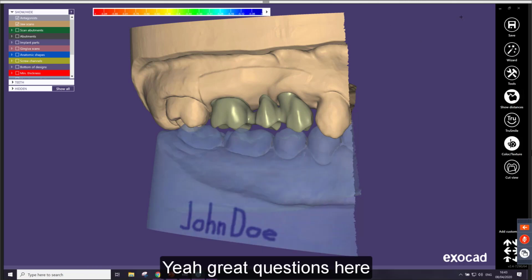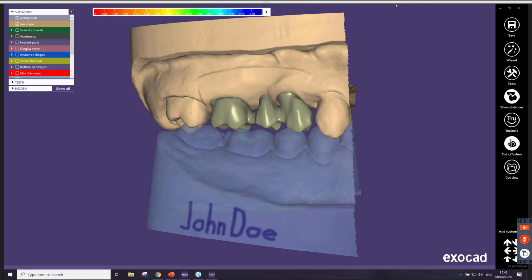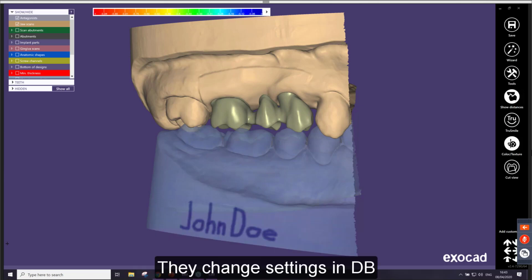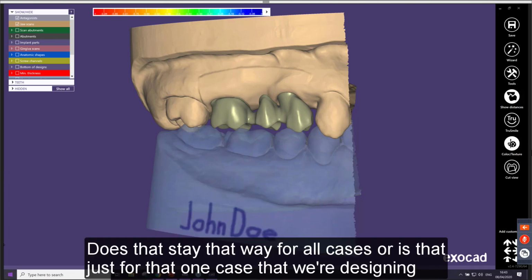Yeah, great job, Tina. Yeah, we do have a few questions here. Okay. Actually, we had a couple questions. This isn't completely pertinent to the webinar, but a couple of people asked if they change settings in DB, does that stay that way for all cases, or is that just for that one case that we're designing?